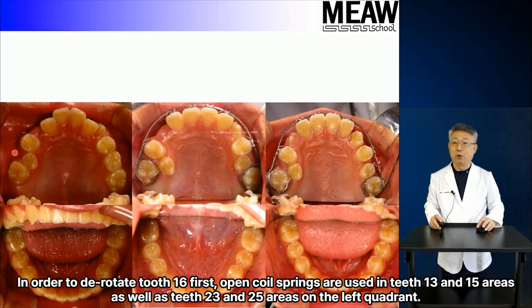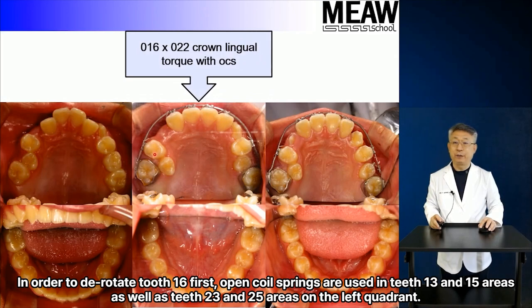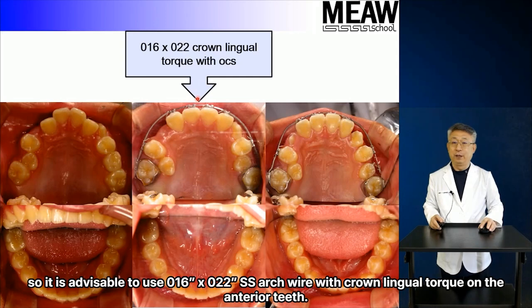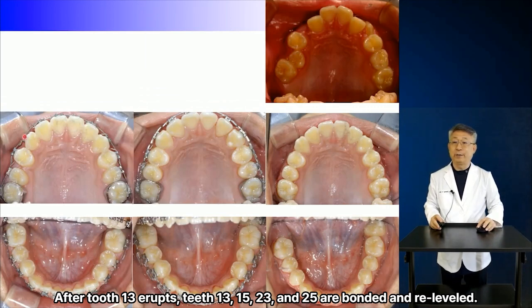In order to derotate tooth 16 first, open coil springs are used in the teeth 13 and 15 areas, as well as the teeth 23 and 25 areas on the left quadrant. The use of open coil springs in 4 areas increases the risk of labioversion of the incisors. So it is advisable to use a 016 x 022 SS arch wire with crown lingual torque on the anterior teeth. After tooth 13 erupts, teeth 13, 15, 23, and 25 are bonded and re-leveled.